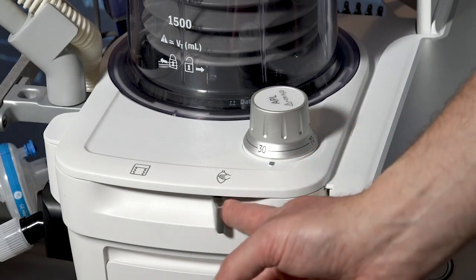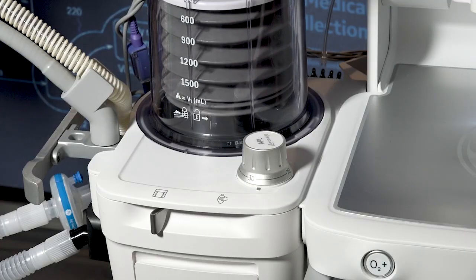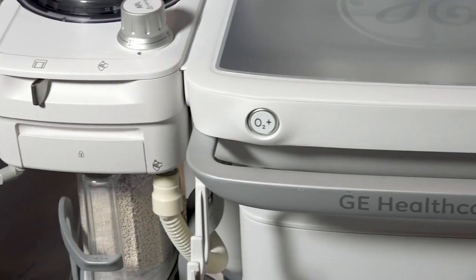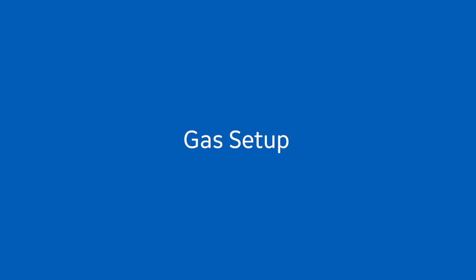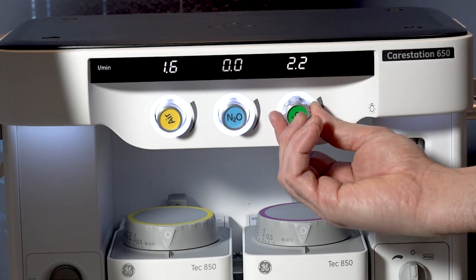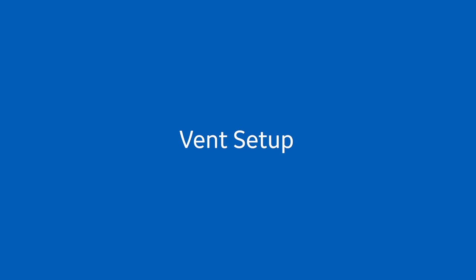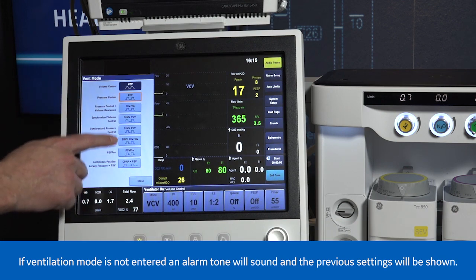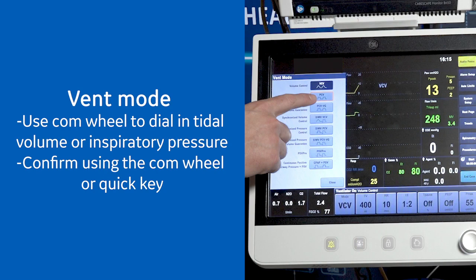Mechanical ventilation begins by moving the bag to vent switch to the vent position. Ventilation will begin at the previous configured or default settings. If needed, press the O2 flush button to inflate the bellows. To set your flow rate, adjust the oxygen and air flow knobs. To change the vent mode, select mode to choose the appropriate ventilation mode for the patient. Use the comm wheel to dial in the tidal volume or inspiratory pressure and confirm by using the comm wheel or by the quick key.